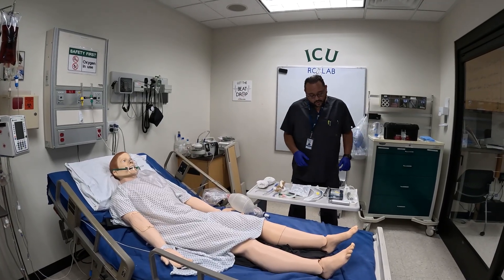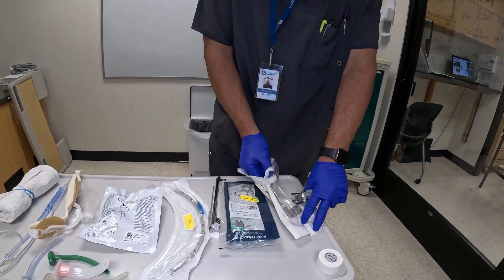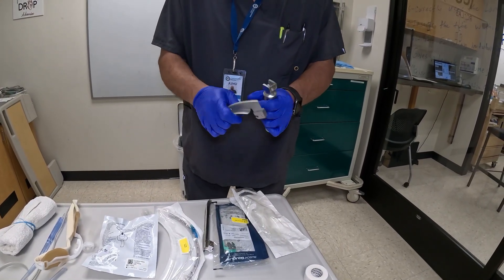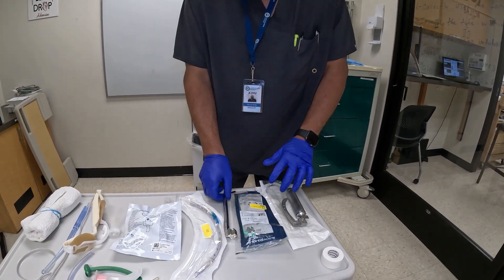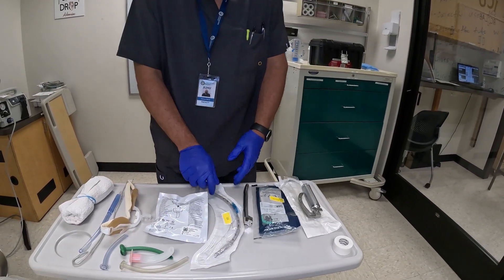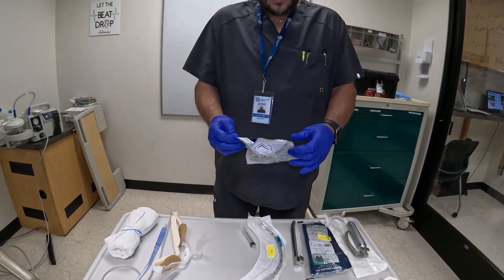You also want to have a laryngoscope. This is my laryngoscope — you want to have different size blades. This one is curved and happens to be a Mac 3. You want to make sure that it works; you see the light come on. For demonstration purposes, I do have a Miller, so we have different blades. I have my ET tube — this is a size 7.